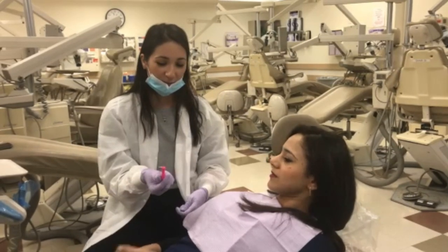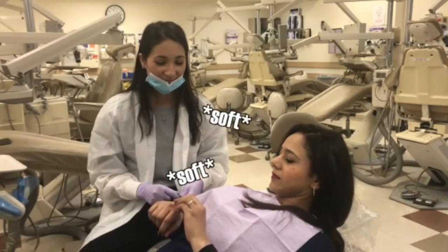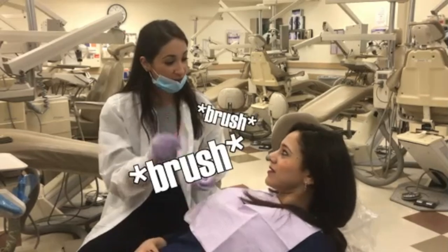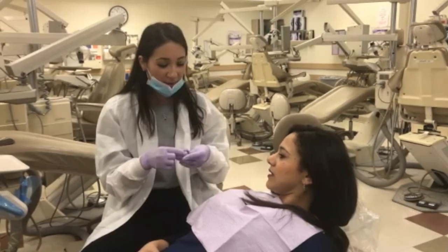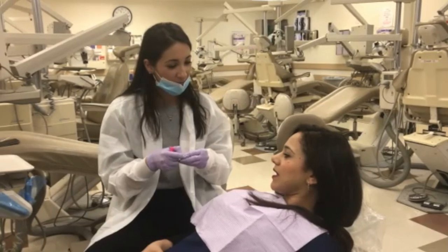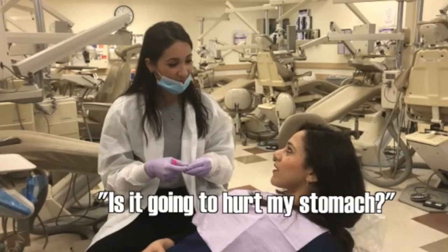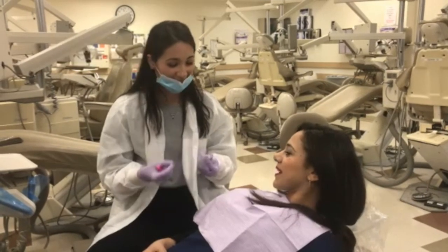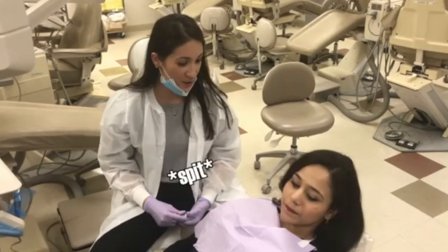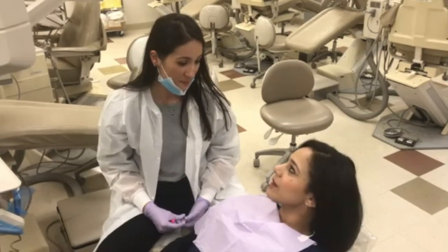You want to try it yourself? See? It tickles. Yeah, it's really soft. We're going to brush your teeth and we're going to massage your gums. And I have a special toothpaste right here — do you want to give it a smell? It smells like bubble gum. Is it going to hurt my stomach? No! Can I swallow it? So at the end, when we're all done, there's a cup right there with water. You're going to spit it all out when we're done. Okay?